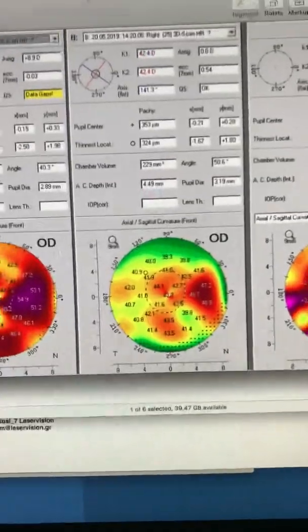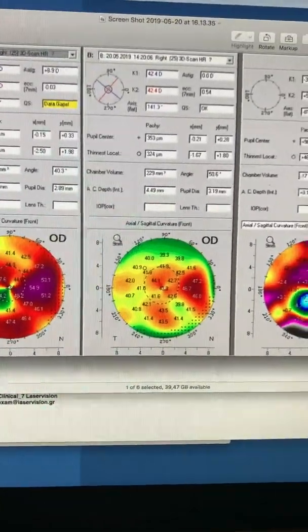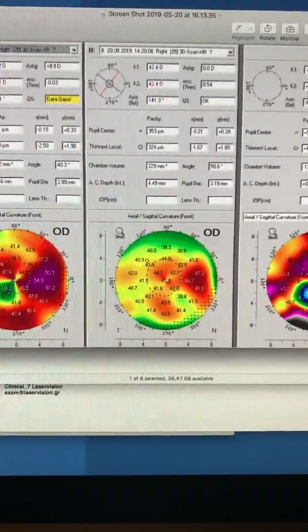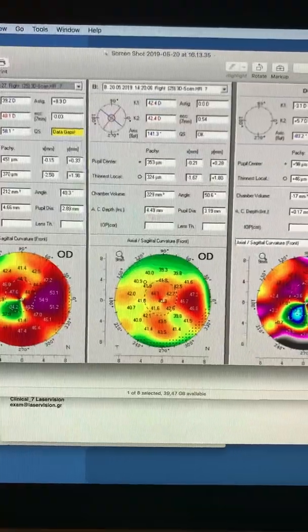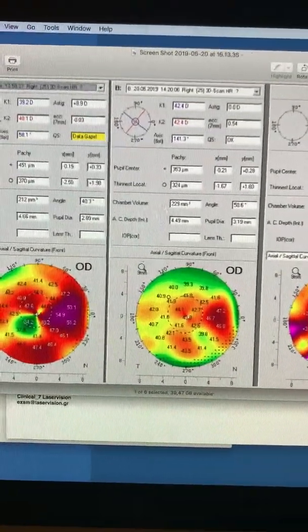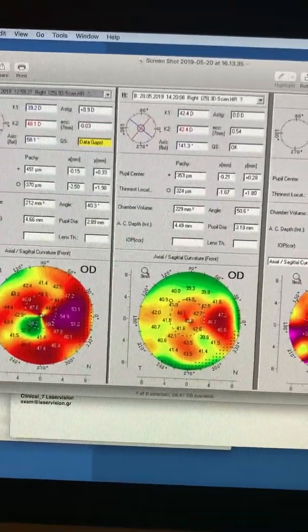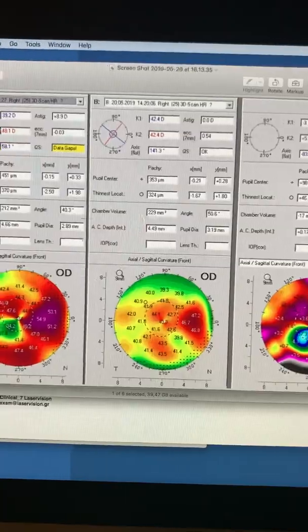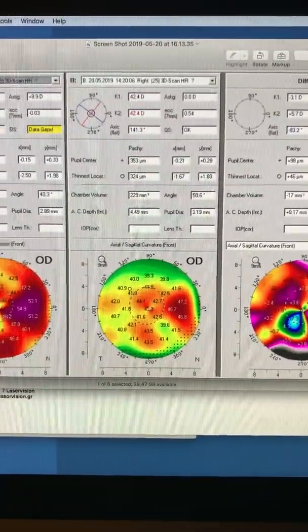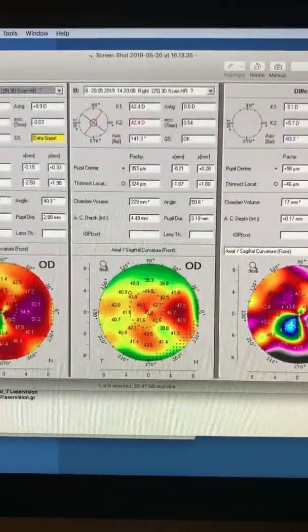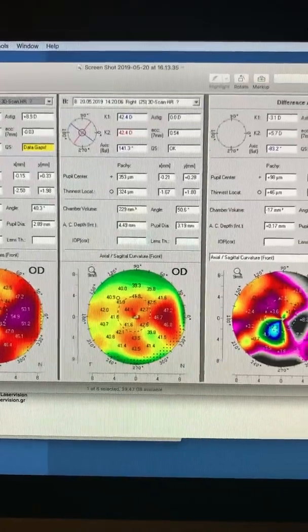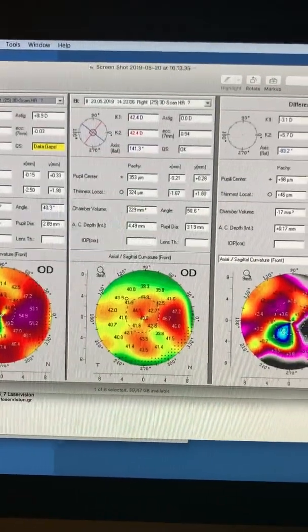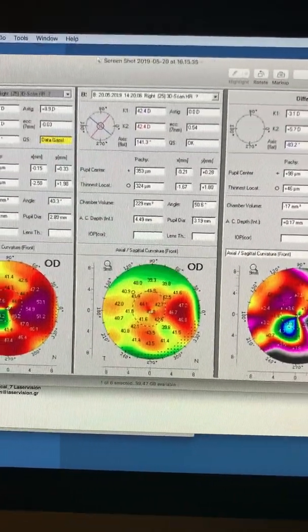And this is after topography-guided normalization. His prescription, as we noted before, was split into a myopic and hyperopic correction in order to reduce the scar. We actually treated with PTK, seven millimeters, 50 microns.